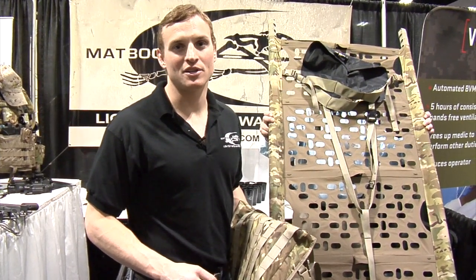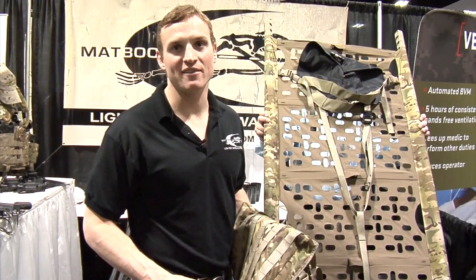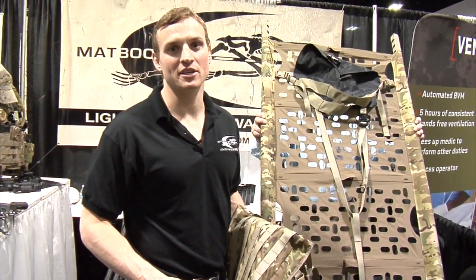Hey guys, Zach here from MATBOCK. Today I want to talk to you about the R-Lift. The R-Lift is a fully rigid litter at only six and a half pounds with a 400 pound carrying capacity. It's the smallest and lightest rigid litter on the market.